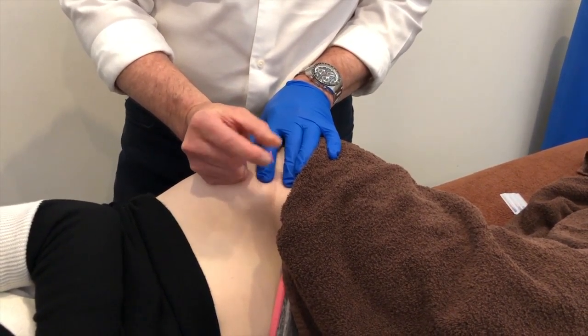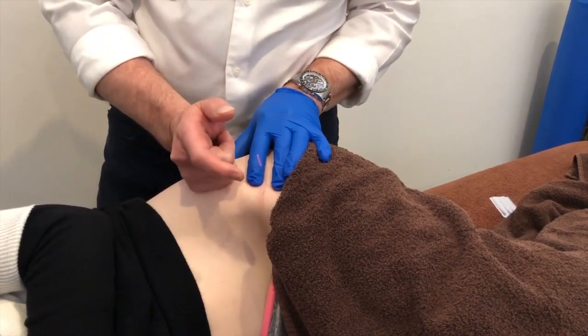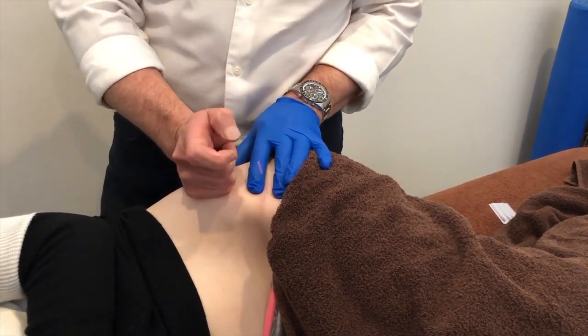Now, let's say that didn't work. It's pretty tough. It's not in this particular one. Very fit and young patient here. So we're not going to find a problem with it. But let's say that didn't work for you. So resting here is the first tip or trick that I would suggest to get that needle in.